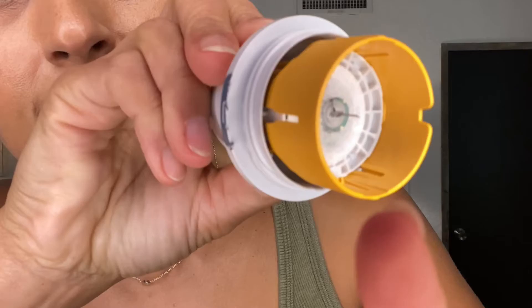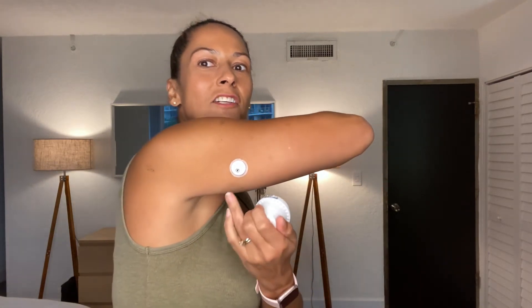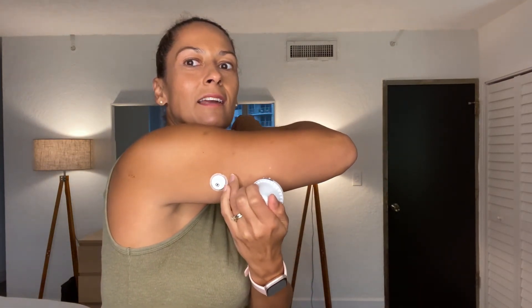See that needle? It's in there. We don't need the outer cap anymore. I'm going to place it on my arm and just push in — and there you go. Just smoothing out the tape.